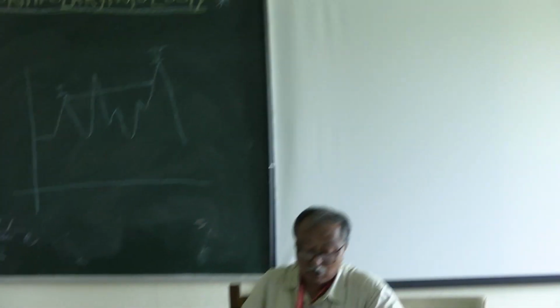What are the uses of the BERA? The threshold of hearing for the children, uncooperative patient, and site of lesion. But it's not so important. Generally, by BERA, we ascertain whether a severe or profound hearing loss is there or not. Now, what is the definite site?